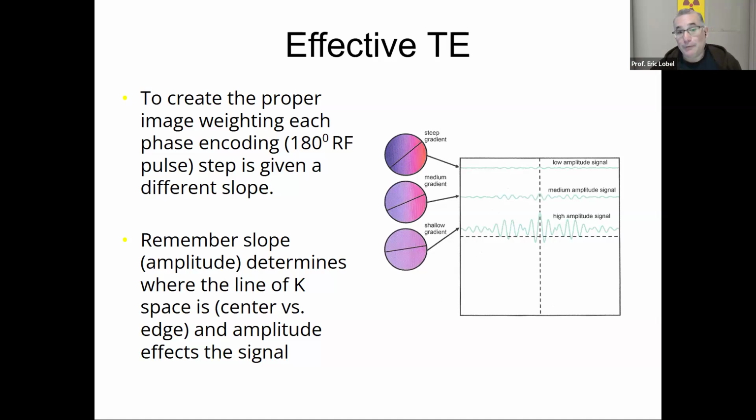It's kind of like an example. So what I mean by that is when it comes to slice encoding, a specific gradient must do a specific slice. And you mentioned Y does coronal, which is true. But you could have alternatively said X does sagittal or Z does axial, right? So all three of them can do phase encoding and frequency encoding, but only a specific gradient can do slice selection.